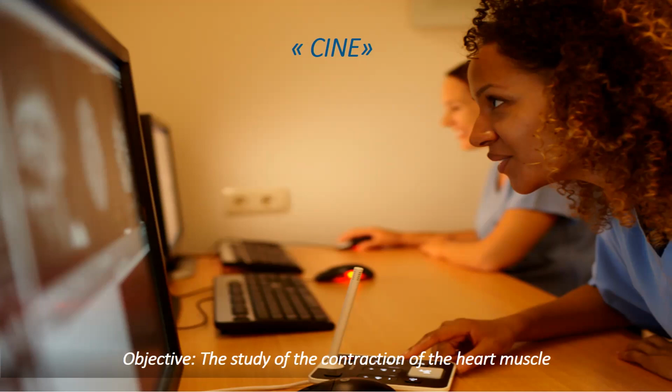In Philips, usually we use the balanced fast field echo sequence. Similar, for example, when some users use Siemens, they use the TrueFISP. It's a very strong sequence, and it's highly recommended for CINE imaging due to its high temporal and spatial resolution, as well as improved blood tissue contrast.